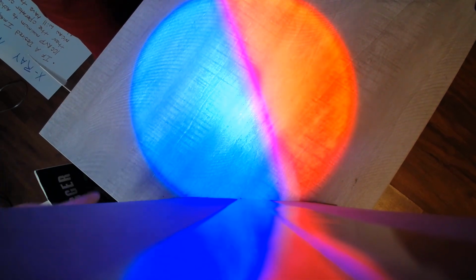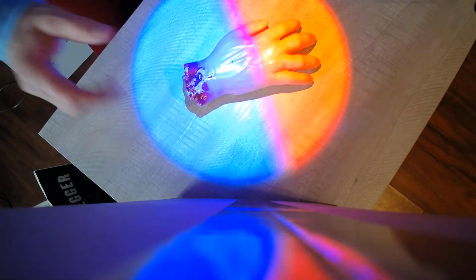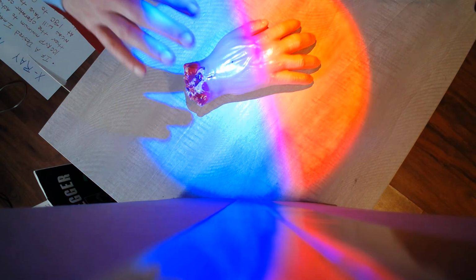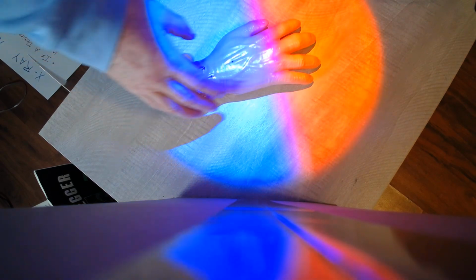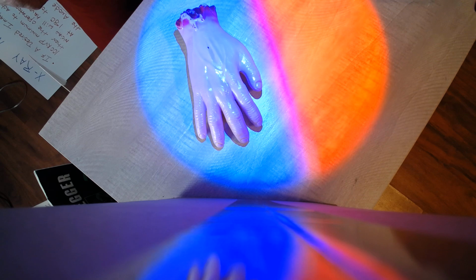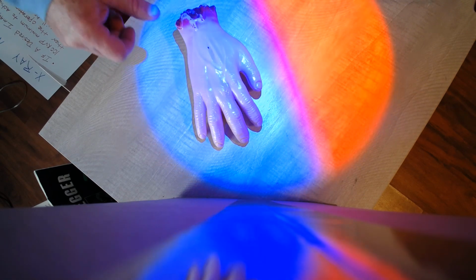And let me get a body part. Now what I would like in the experiment is to take a phantom and take a normal X-ray, and that would set the kVp and mAs. Then for experiment 2, I'd like to move the body part, or the phantom, into the cathode or the anode side first.